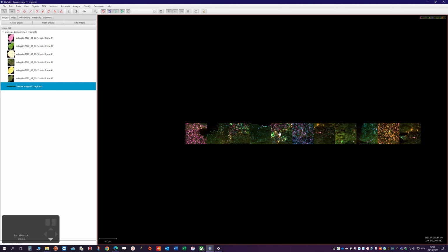But this background class is actually specific to the channel. So while you use it at the same time for all the images, you cannot use it on the same image. That means you have to split the image into its different channels so that this background class is actually specific to the channels and not the same for all the channels.